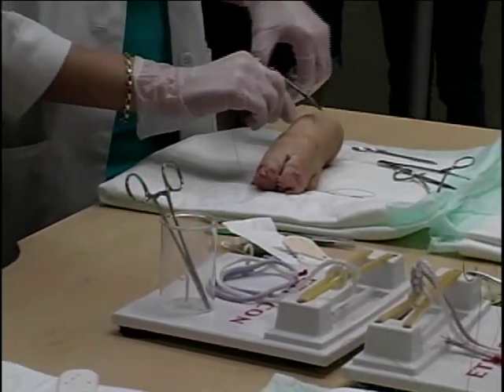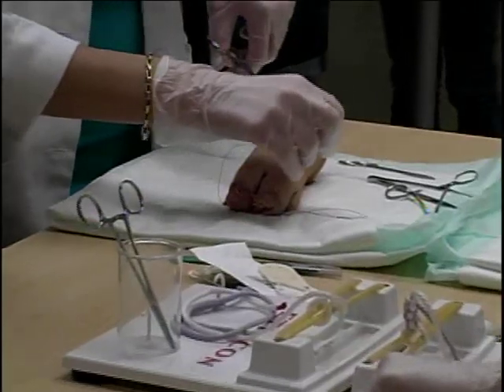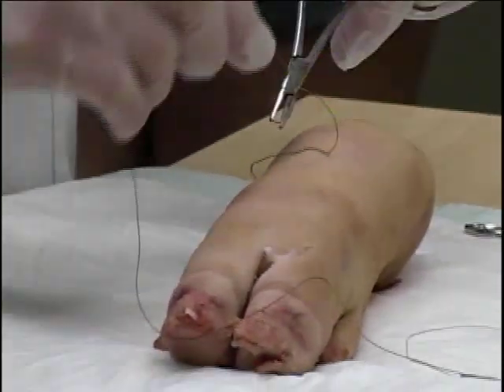For many of them, this is the first time they've ever held a suture, a needle driver, pickups, or any of those sorts of things. It's a very low-stress setting — it's not on patients, it's on pig's feet — so everybody wins in a low-stress environment. They get one-on-one instruction as to how to do it properly.